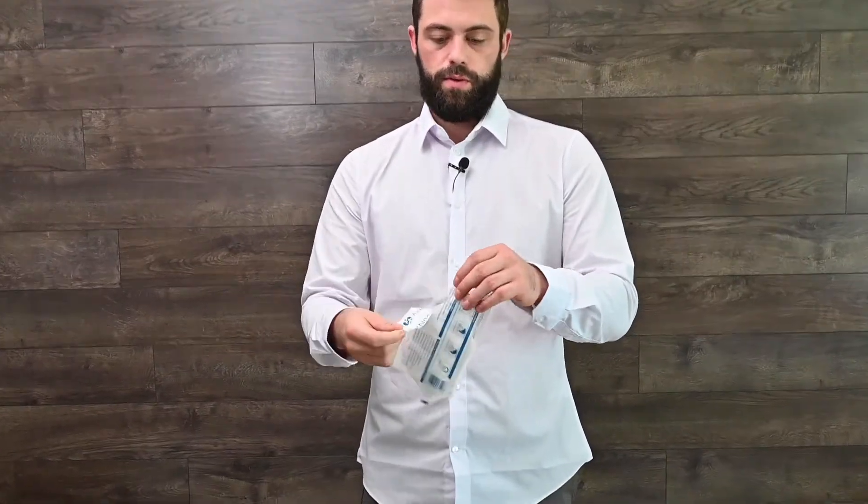These are the KN95 masks — the ones that you get in a pack of two. Each individual KN95 mask is individually sealed like this. We're going to show how we open it.